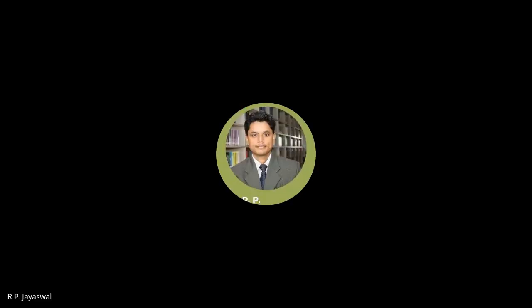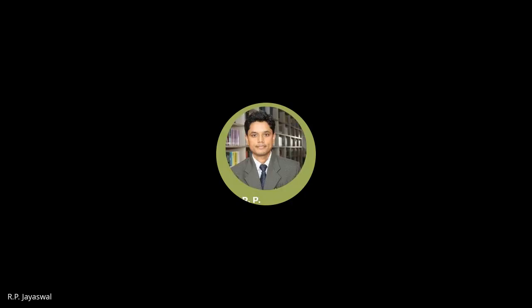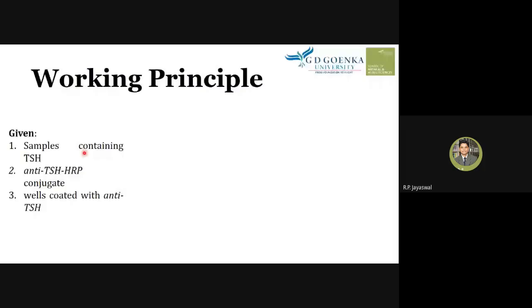So working principle: let's know how this TSH measurement based on ELISA works. Here we have been given samples containing TSH. We have a serum sample where we need to know the concentration of TSH. Then there is the anti-TSH HRP conjugate.